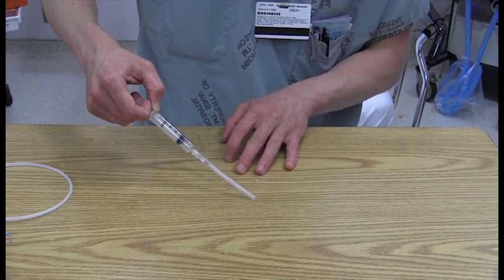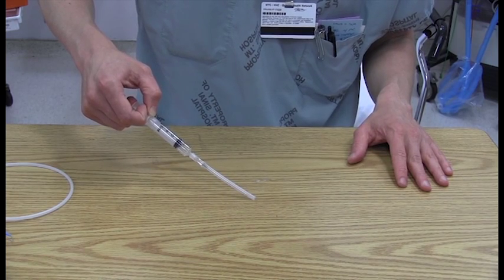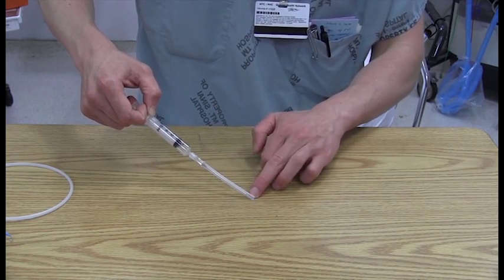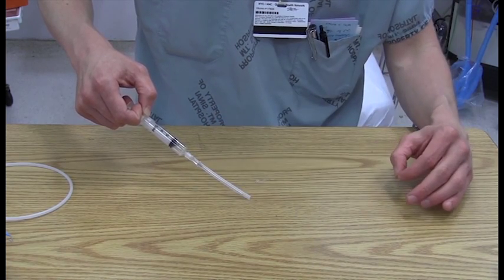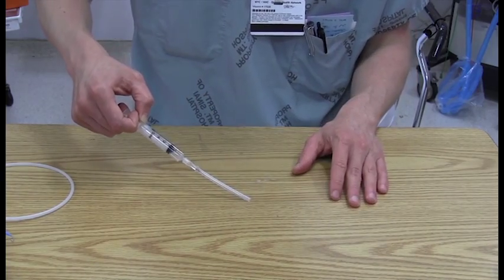And this is the micro skill I think people fail at most. So what you need to be able to do is stabilize the needle in such a way that there is no movement at all of either the needle tip in the vessel, causing vascular trauma, or the hub, which might push the needle in a little bit further, and now you won't be able to pass a wire or actually pull it out of the vessel itself.